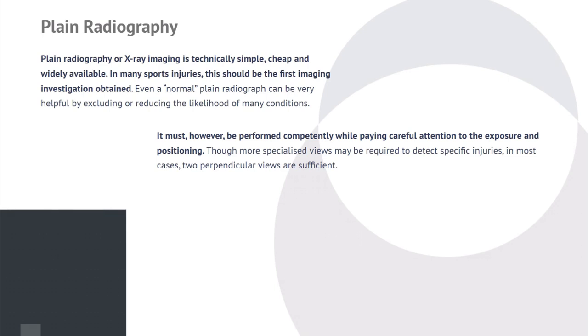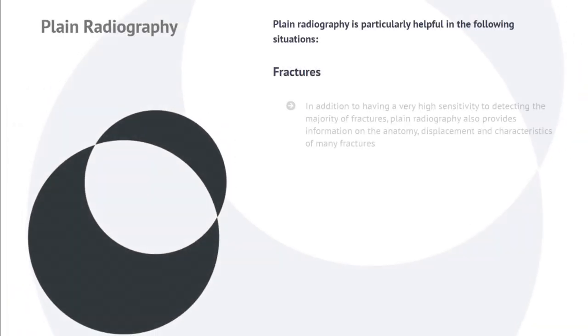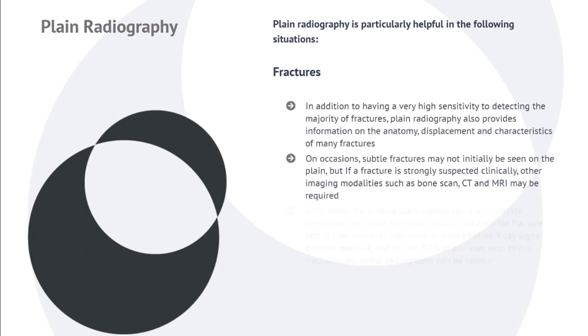It must, however, be performed competently while paying careful attention to the exposure and positioning. Though more specialized views may be required to detect specific injuries, in most cases, 2 perpendicular views are sufficient. Plain radiography is particularly helpful in the following situations.